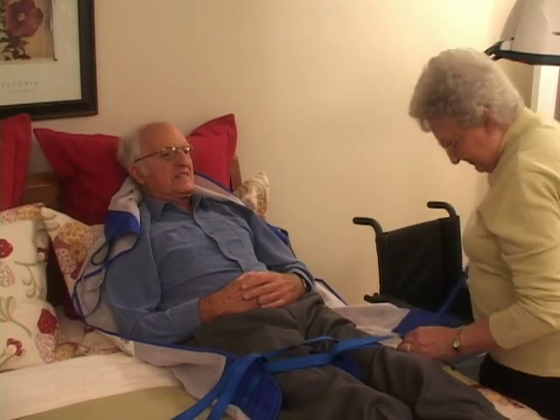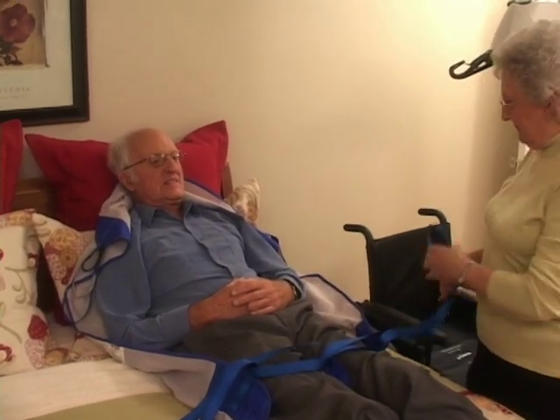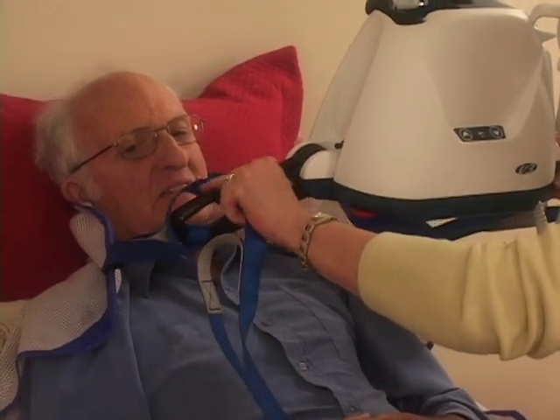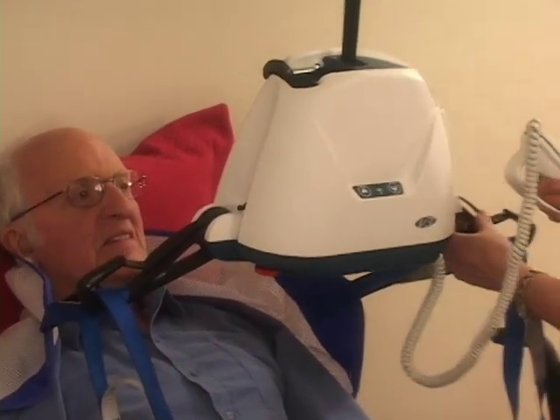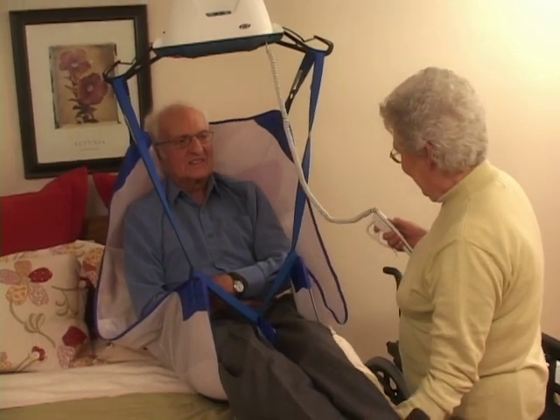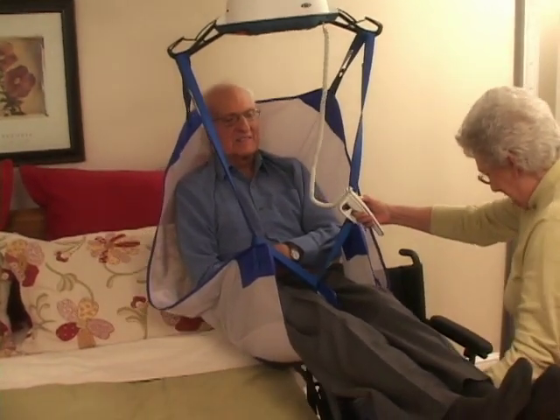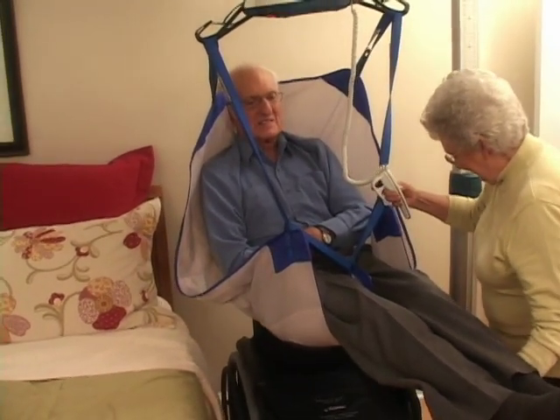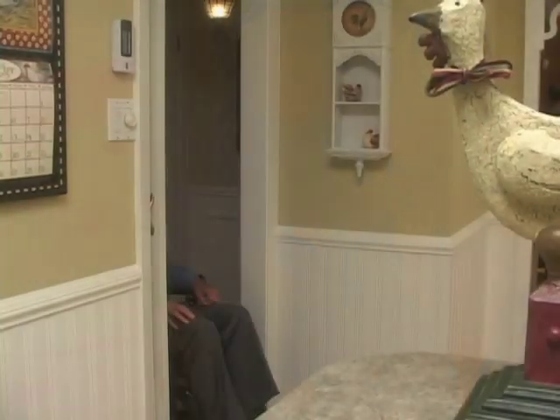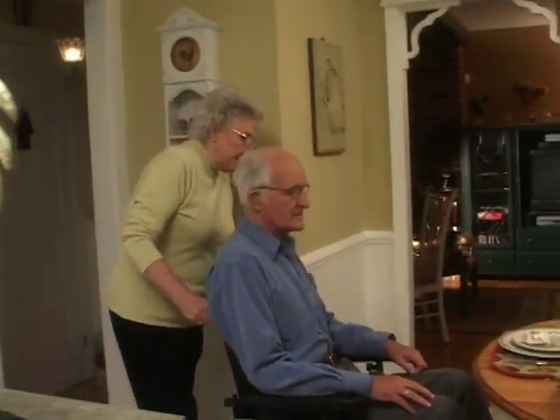The EasyTrack FS is a free-standing, versatile solution for all sorts of point-to-point transfers — wheelchair to bed, bed to chair, even in the bathroom — anywhere there is a lift and transfer need. This equipment was designed to allow those with a mobility impairment to continue to live at home and enjoy many of their normal activities. With the help of their partner, safe and dignified transfers are easily accomplished.